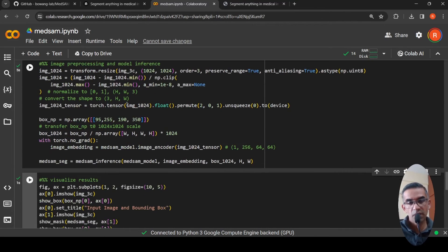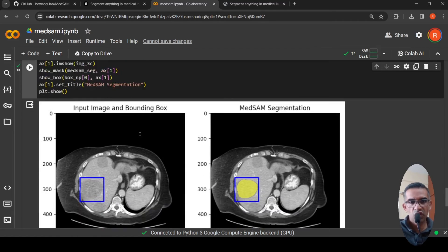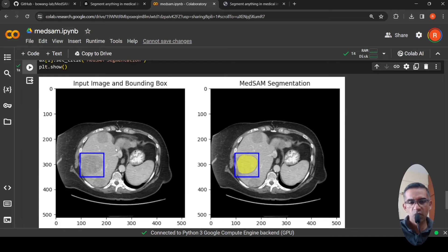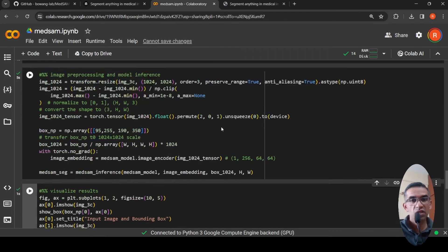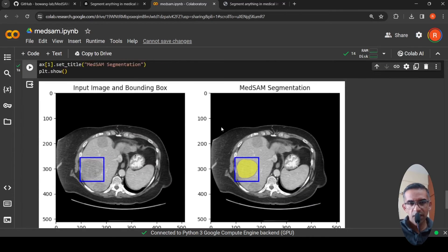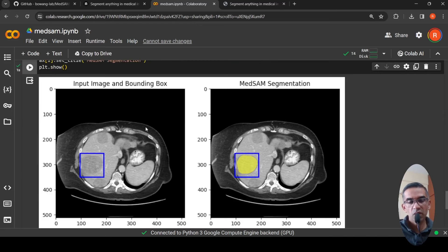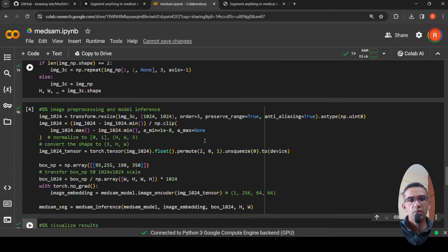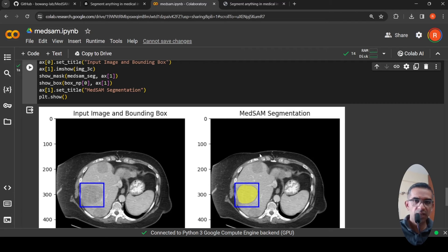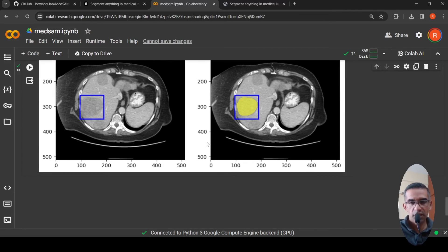An example shown in the notebook includes the input image with a bounding box and the resulting MedSAM segmentation. There is an abnormality in the image with a bounding box around it, and MedSAM segments it accurately. You can try this notebook with your own images by providing the input image along with the bounding box coordinates.